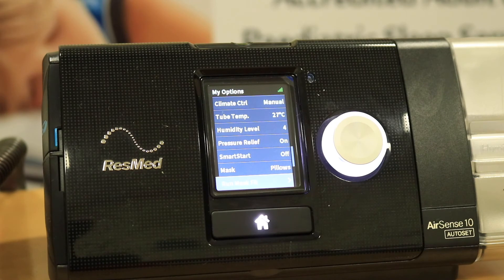This mask fit function basically applies a higher fixed pressure and it will give you an idea of how well the mask is sealing.